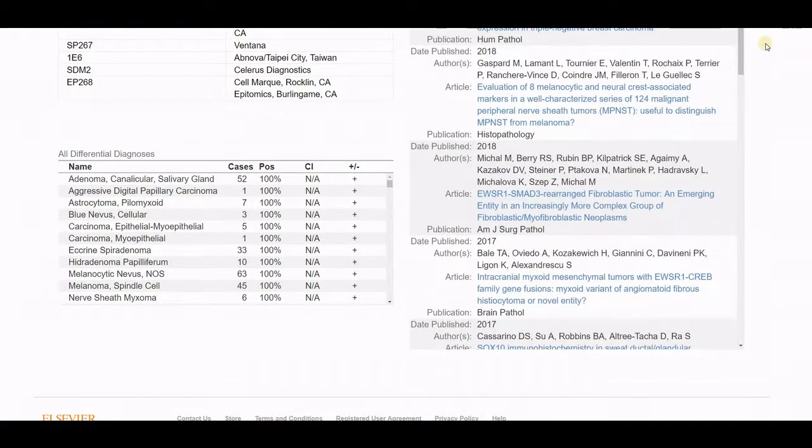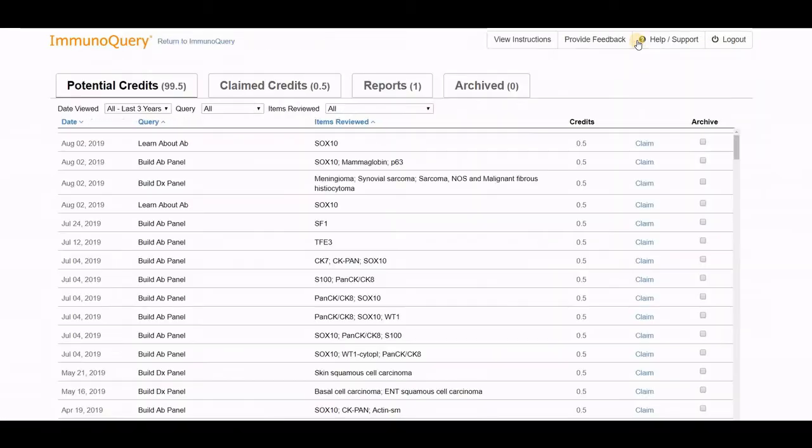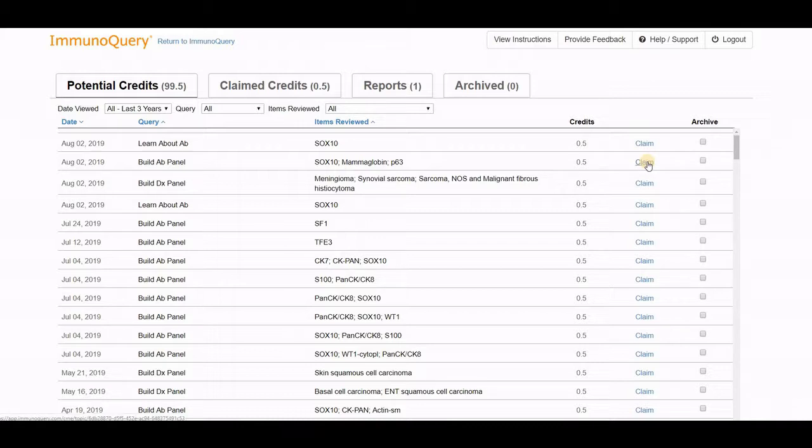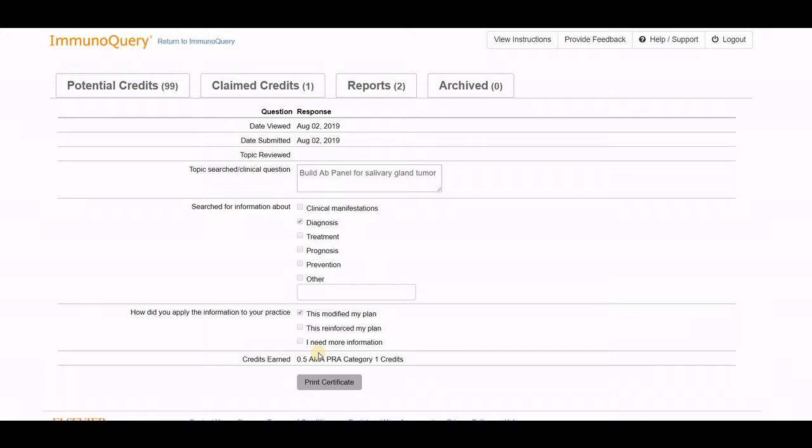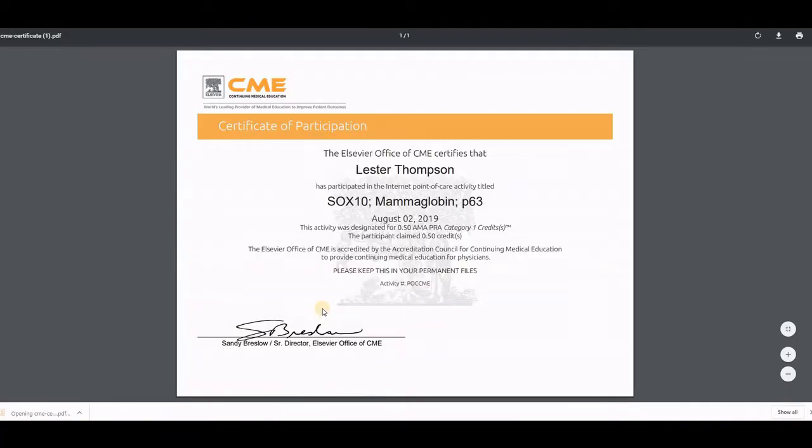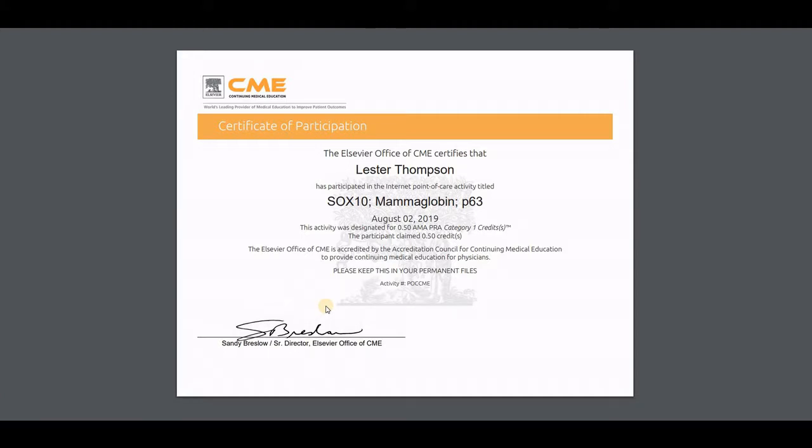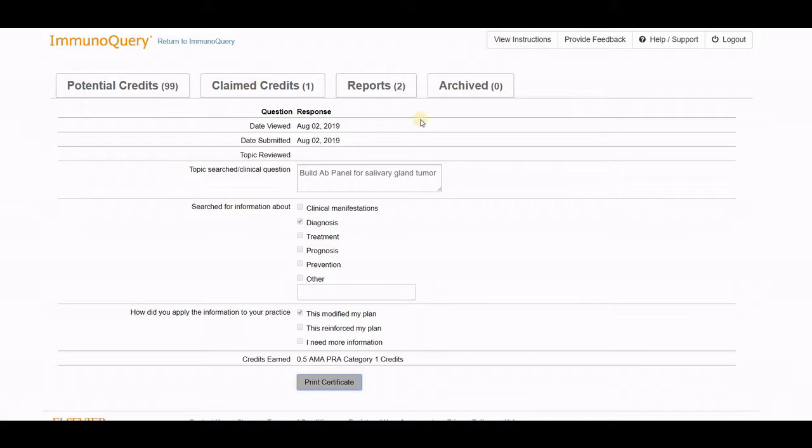The final function I'd like to briefly show is the CME. If you click on the CME button, it takes you to the CME page. Here are all the various topics you've learned about. Here is building of this antibody panel, and I'm going to claim credit for this topic. It asks what you wanted to do. Maybe I'll say build an antibody panel for salivary gland tumors, that I was going to use it for a diagnosis, and it modified your plan. You submit for credit. It immediately generates a certificate, and you can print it out and send it to whoever keeps track of your Category 1 credits. A very nice function with CME available.